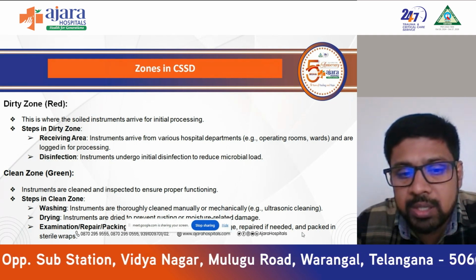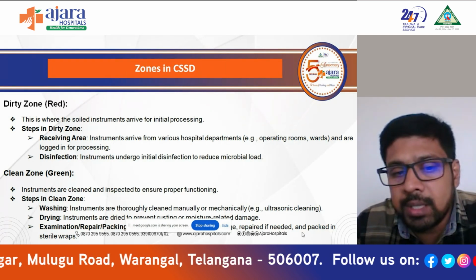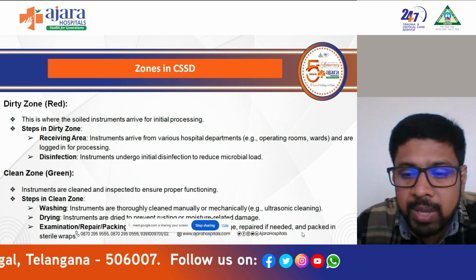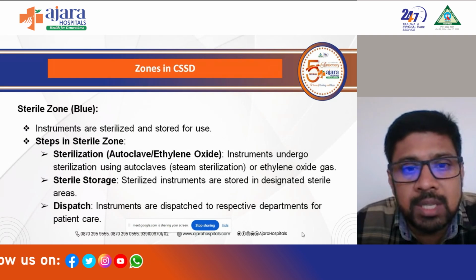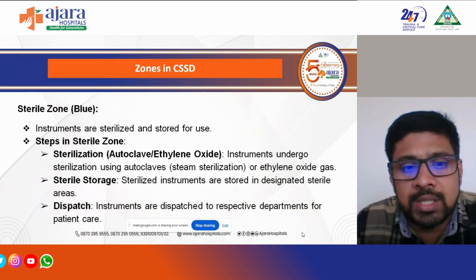The technician will inspect the condition of the instrument, and if any repair is needed, they repair it, and then it's packed in the sterile wraps. Then the sterile zone: the instruments are sterilized and stored in a storage area.